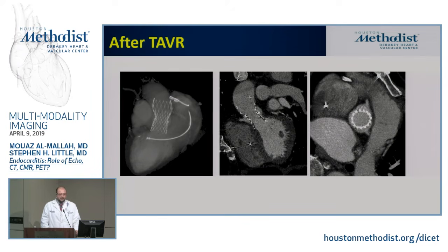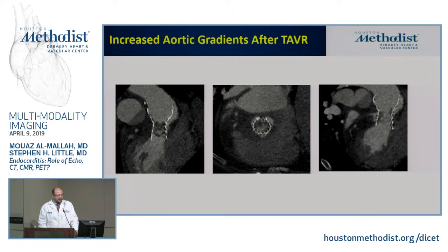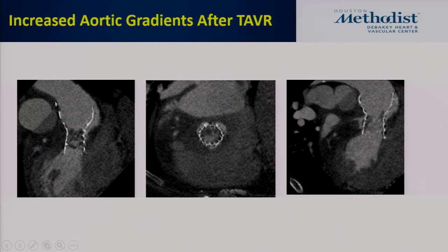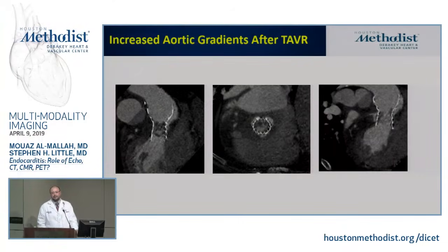The patient was so dyspneic, we wanted to get a TEE, but she was going to require intubation to do it. So we did a quick CT, and now you can see all of this fibrin material in the prosthetic valve. This patient was started on anticoagulation, but she had a PEA arrest 12 hours after this CT, and she died. So these patients actually deteriorate very quickly, and remember, there are comorbidities, at least in the early days of TAVR. These are the patients who got TAVR because they are not good surgical candidates, and they had multiple comorbidities, advanced lung disease, and others.